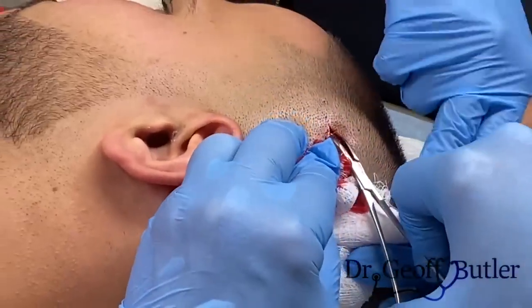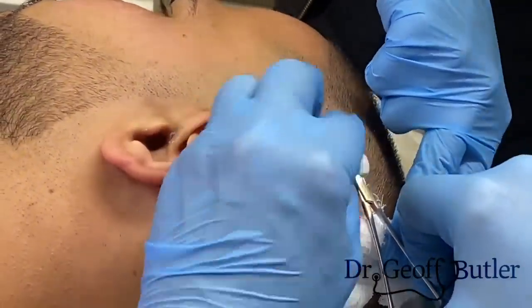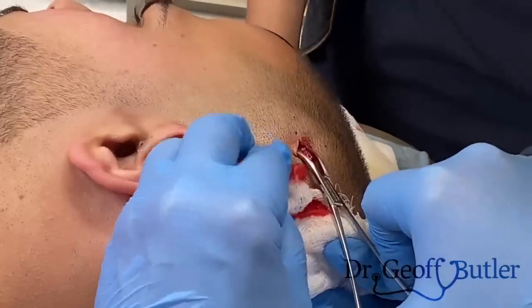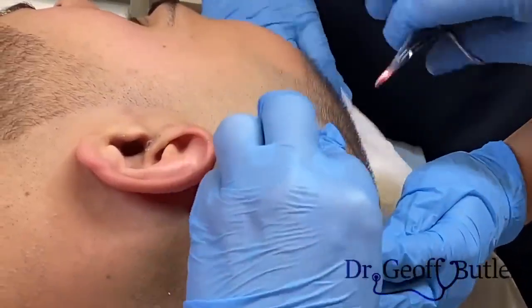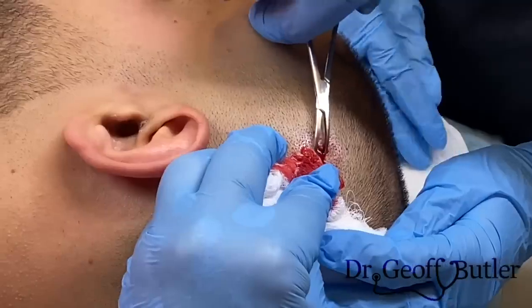It's not hurting at all? No. What do you think? Does it look like cyst membrane? Looks like it. Yeah, I think so. Sometimes you can have a very thin membrane still sitting on top of it that we have to get through, and I think that's the case here.